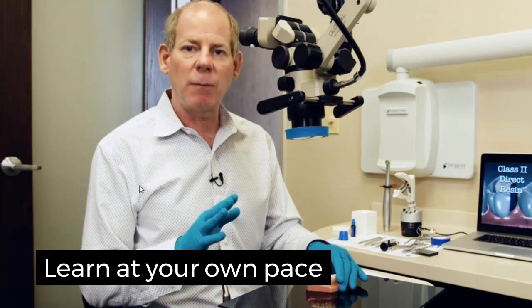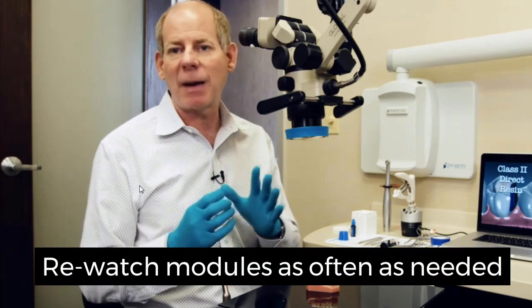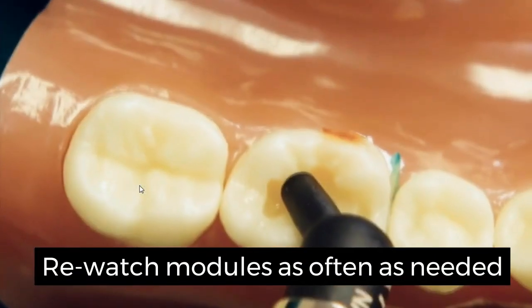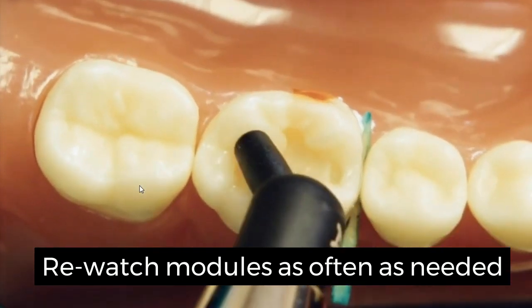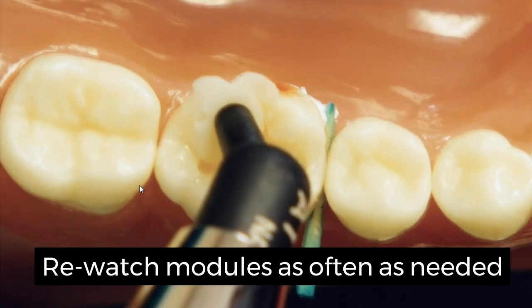I'm going to start building up the occlusal portion of the tooth, doing one increment at a time. Again, doing an oblique layering technique as we described to minimize the stresses as the composite cures. Starting at a 45 degree angle, injecting the composite, using the tooth to cleave off the excess composite.